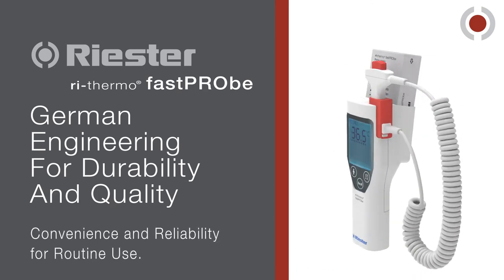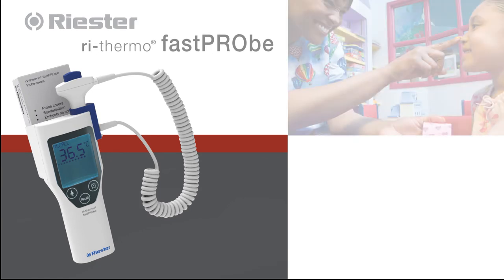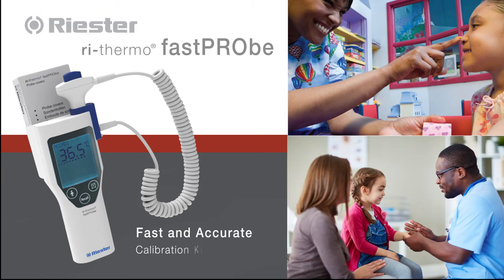The ReSTER ReThermo Fast Probe is a versatile, German-designed, engineered, and manufactured general-purpose thermometer. Its robust design with convenient probe storage is perfect for everyday clinical use in a multitude of care settings.